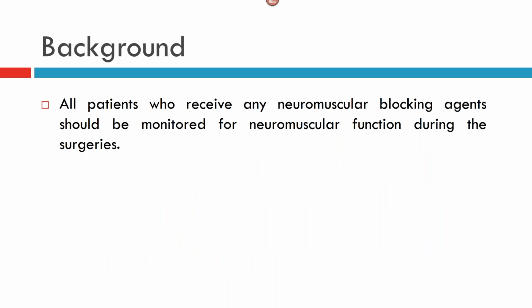All the patients who receive any neuromuscular blocking agent should be monitored for neuromuscular function during the surgeries.